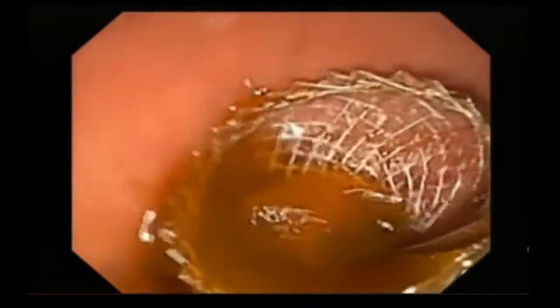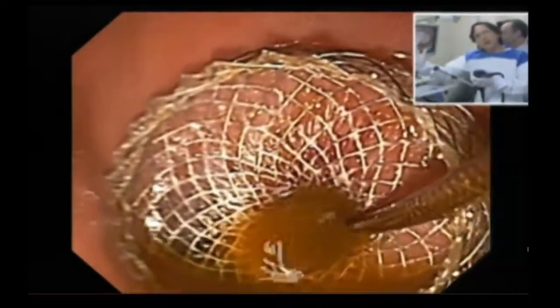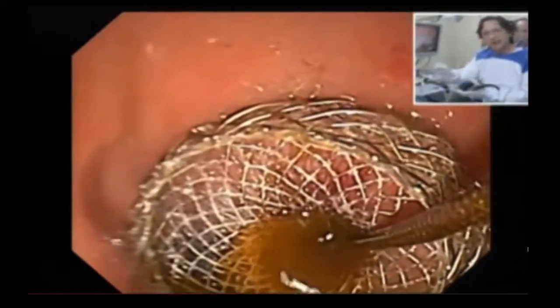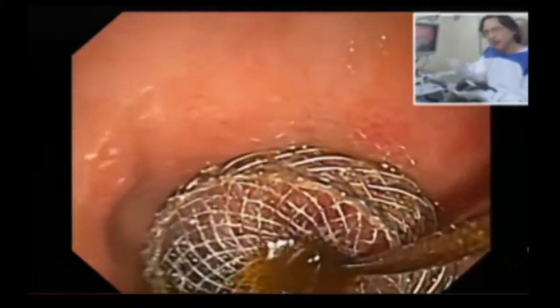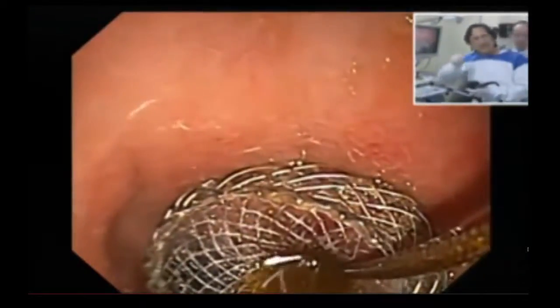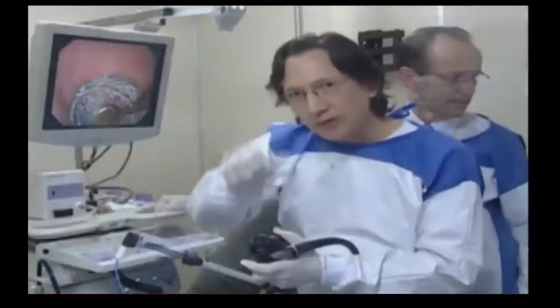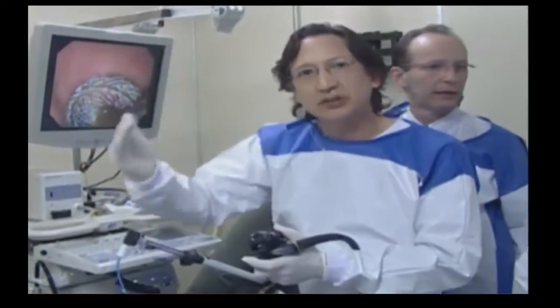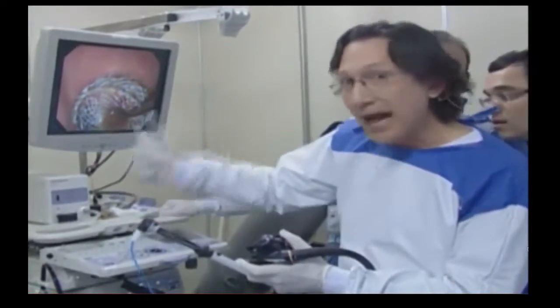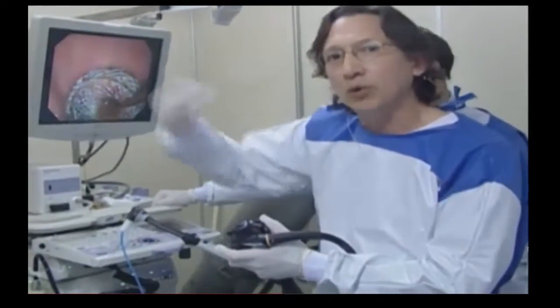So you can see the proximal flange. Because we have two flanges, proximal and distal, that are lumen opposing, we don't have to worry about accidentally dislodging the stent as we advance the scope into the cyst. So the idea today is to use the stent not only for the drainage, but as a port to do endoscopic intervention in the extraintestinal lumen. So it doesn't matter if you're in a pseudocyst or the gallbladder or the bile duct, everything becomes a continuum with the GI tract.